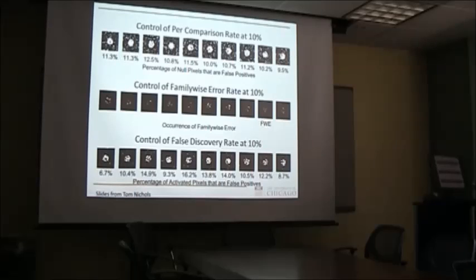So what you would see is that if you look at all these different options, by not really using the correction method, you're going to keep most of the stuff that was originally signal, in the middle. But you're also going to get a lot of stuff outside this little red border, which you knew in this example was just noise.